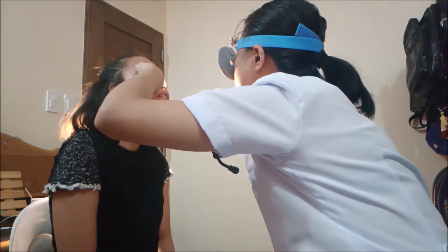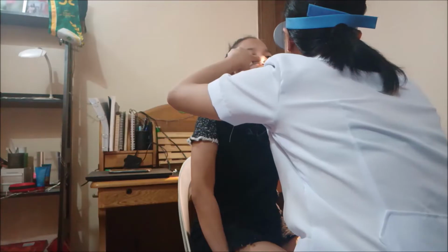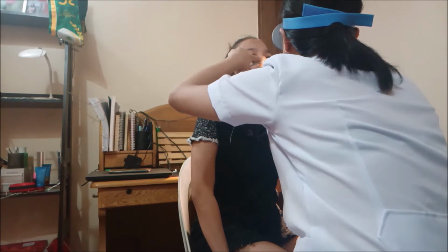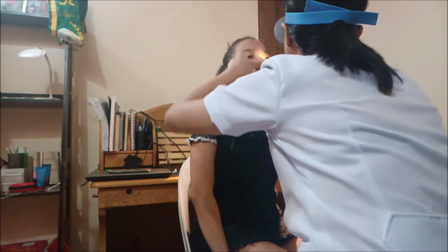Assess the nasal floor, inferior turbinates, and anterior septum for any lesions or defect. We remove the nasal speculum by withdrawing it from the patient's nose with the blade slightly open. Accomplish this while avoiding causing pain and discomfort to the patient.